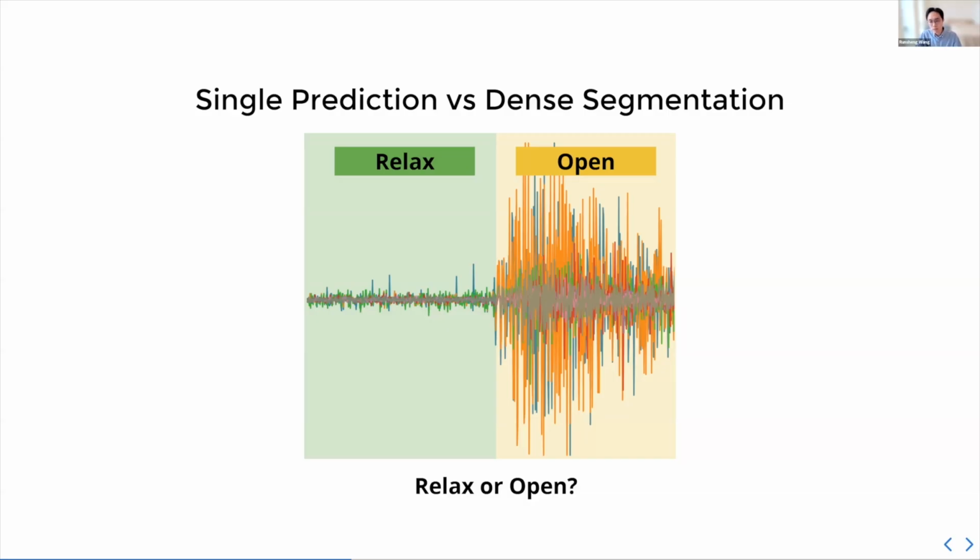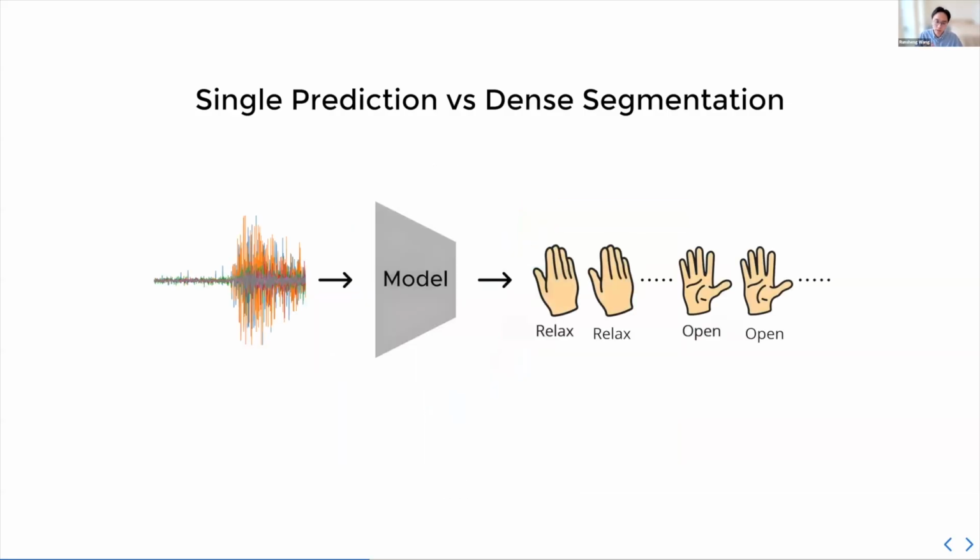So therefore, we make this one simple change, which is that instead of predicting a single label, we're predicting essentially a dense sequence, right? And it's as dense as the number of time steps that we have in the window. So this is very similar to image segmentation, where you provide a label for every pixel. We're labeling every single time step. So if it's 600 time steps in the input, 600 predictions will be made, one for each time step. So this allows us to learn on a much finer scale and reduce or remove this ambiguity problem altogether.